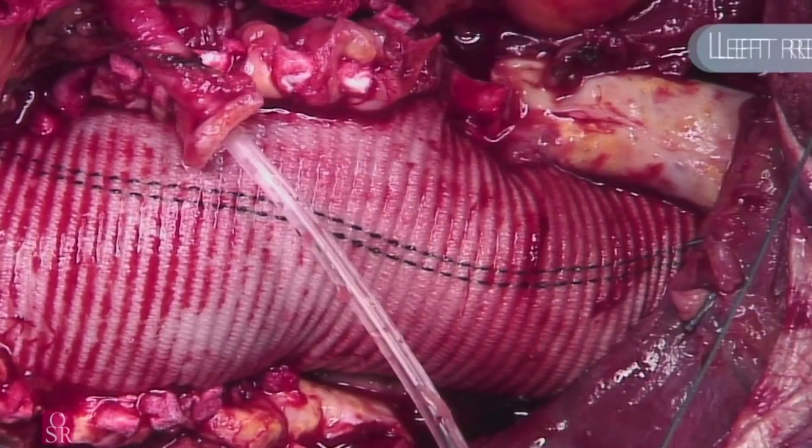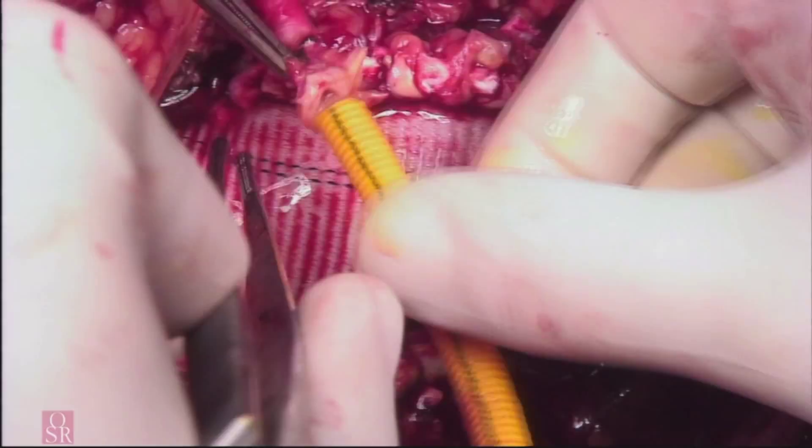Usually, the left renal artery is reattached separately by an 8 mm Dacron graft interposition.